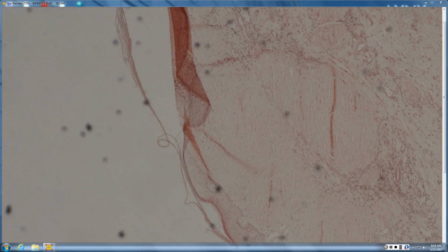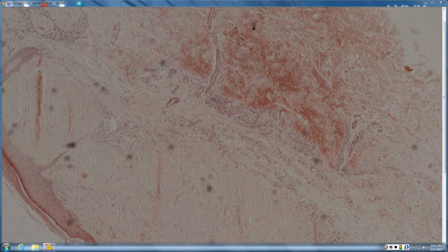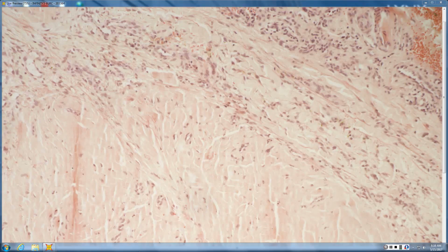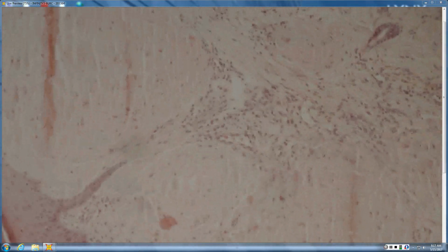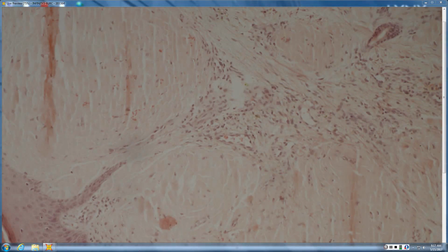Let's see. Okay. There's maybe scar and I'm not sure. Sort of amorphous pink stuff. Yeah, that is distinctly fissured and cracked. So amorphous pink stuff, fissured and cracked, sitting in the dermis, amyloid, associated with red cell extravasation. So amyloid would be absolutely your thought. This was a patient with Waldenstrom's and deposition, but amyloid, thioflavin T would be a great stain.